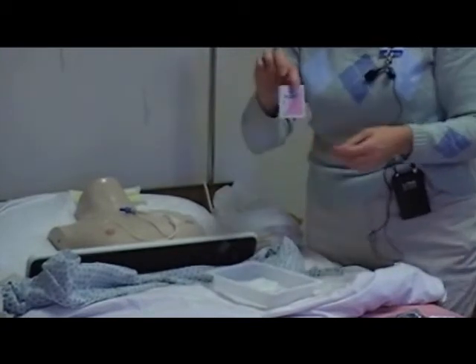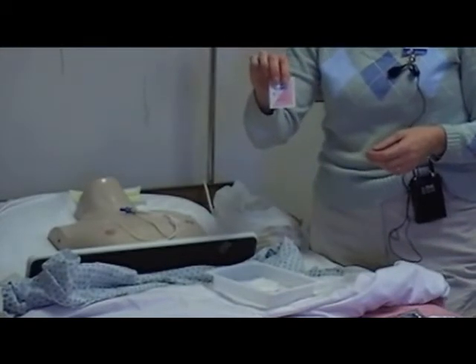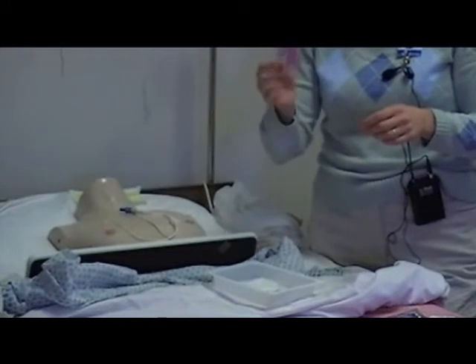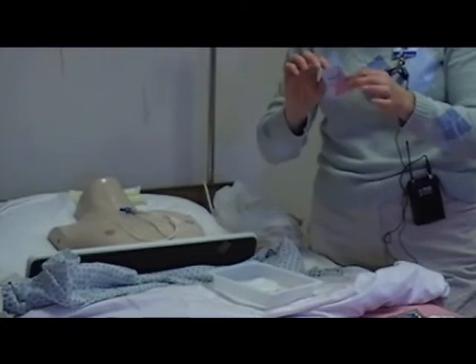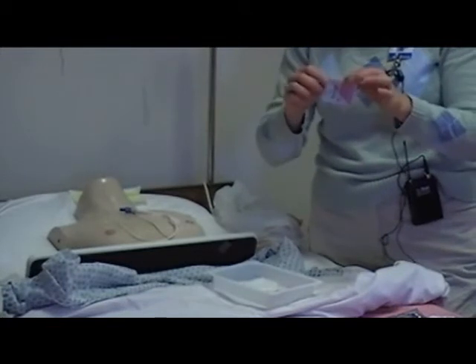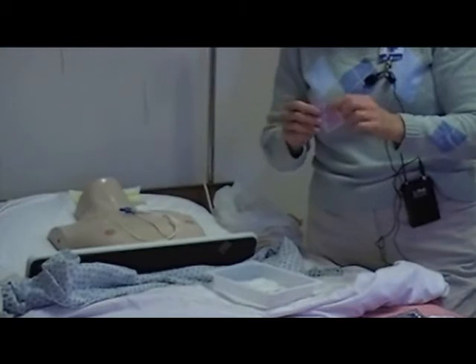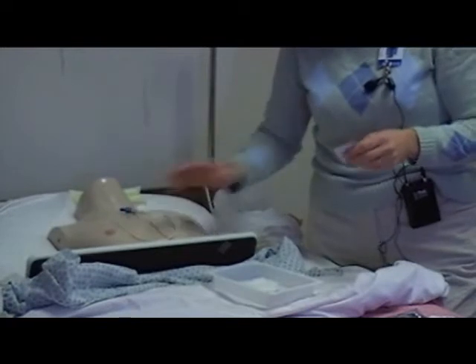Also, what you have in here is a protective wipe. If you have a person whose skin is very fragile, maybe it's an individual that it's harder to get the Tegaderm, there's all sorts of different terms, that transparent dressing to stick. After you have used the ChloraPrep and allowed the ChloraPrep to fully dry, you can then open up this. It will look a lot like an alcohol swab. It smells a little bit different though. It smells a little sweeter. You can open that up, swab the area over which the dressing is going after the ChloraPrep is dried, and this will also act as a further barrier to protect his skin from the adhesive of the dressing.